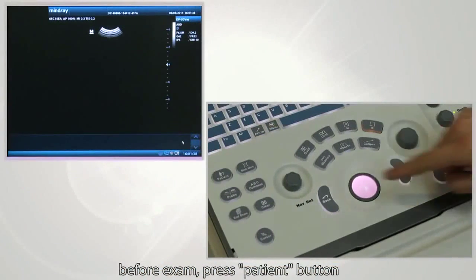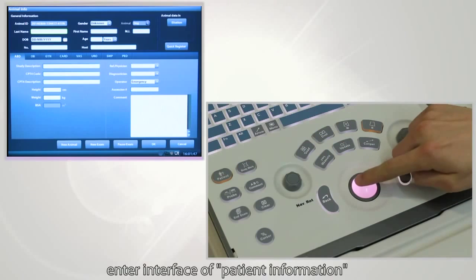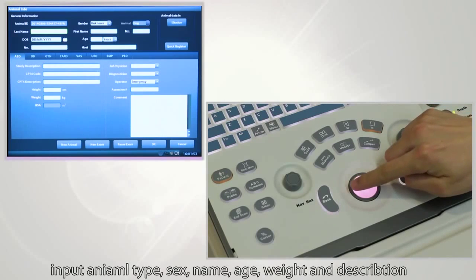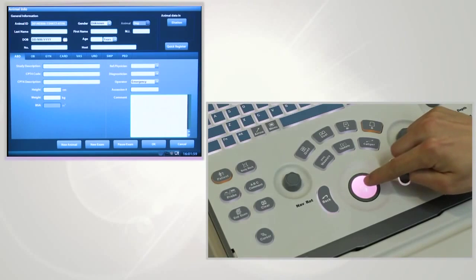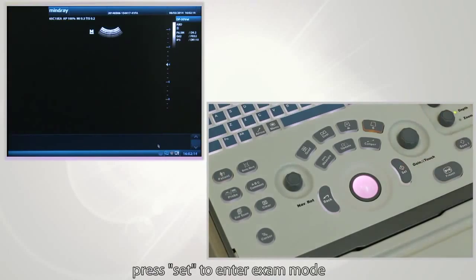Before the exam, press the patient button to enter the interface where you can enter patient information. Input animal type, sex, name, age, weight, and description. Press Set to enter exam mode.